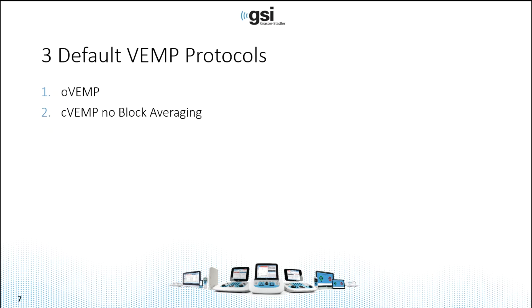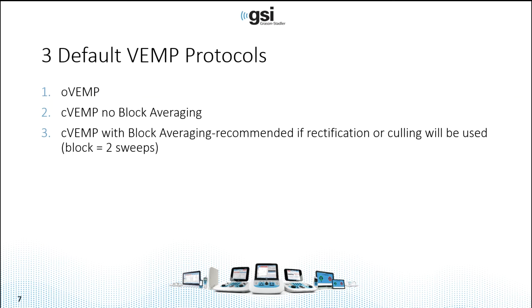There are three VEMP protocols within the EP module: an OVEMP protocol, a C VEMP protocol with no block averaging, and a C VEMP protocol with block averaging. It's recommended that you use the block averaging protocol if you're going to use rectification or if you're interested in culling and viewing each sweep. The reason you don't want to use it routinely is that it takes longer — block averaging lengthens the time because it has to store information for each block. So only use C VEMP with block averaging if you're going to use rectification or culling.